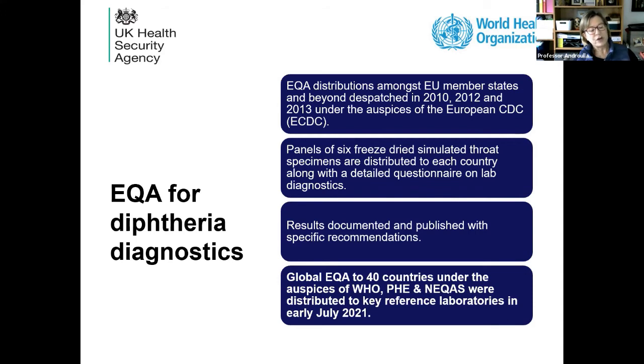And with those dispatches, we had 6 freeze-dried simulated throat specimens, which were distributed to each country, and the results were documented, and there are various publications on the results.